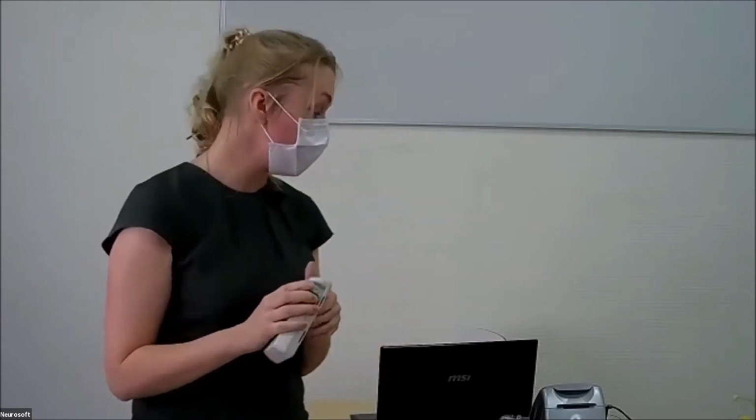And the patients stay at home, and we perform the routine test, which we know is the gold standard for diagnosing sleep disturbances. We can perform this ambulatory test with video recording and without video recording. In accordance with the American Academy of Sleep Medicine recommendation, video monitoring is now recommended for sleep study.